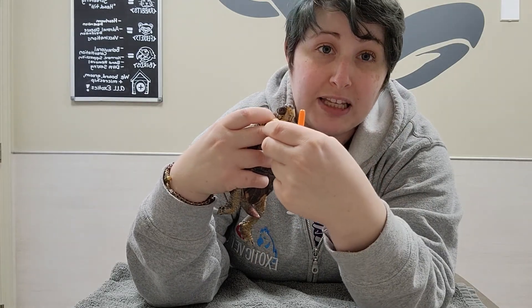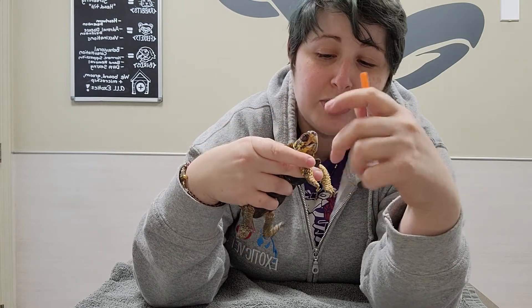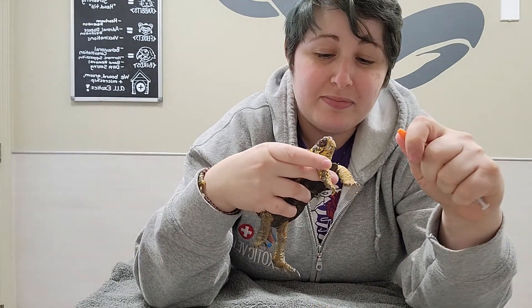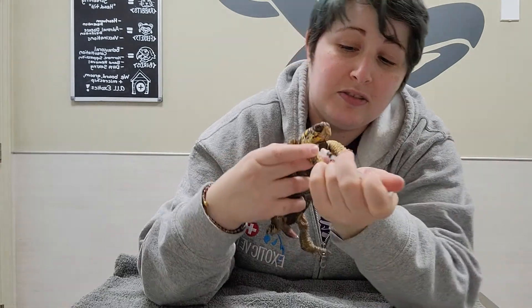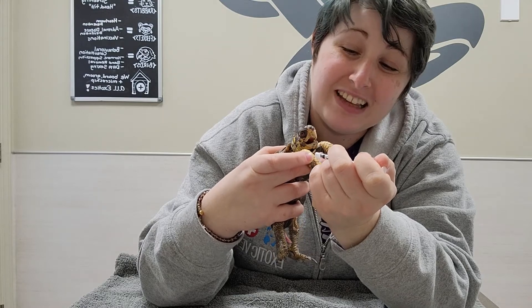Sometimes if they're in their shell, you have to use the meat in their forearm up here if you can pull them out. You can see he's kind of snapping at me, so definitely watch yourself while you're giving the injections to make sure that you don't get nipped.